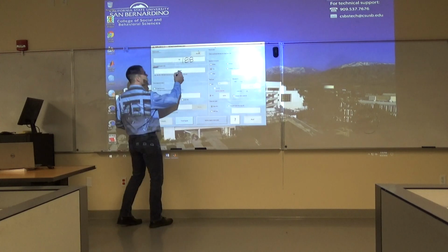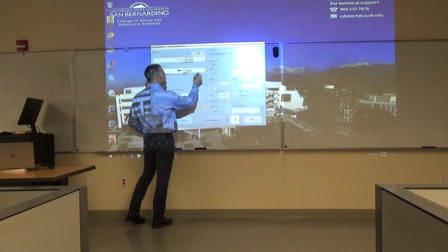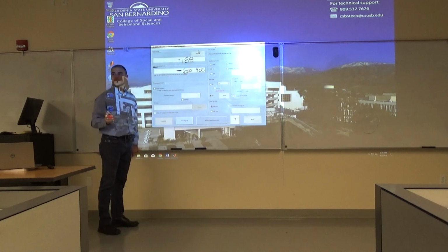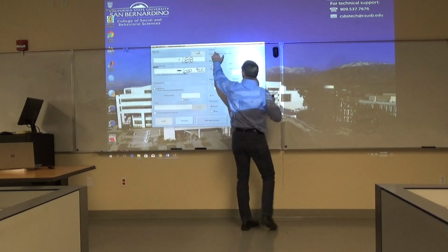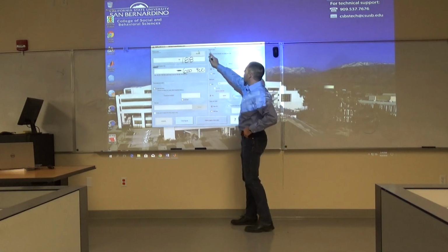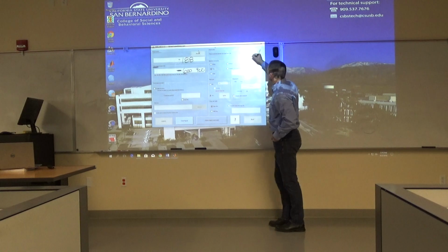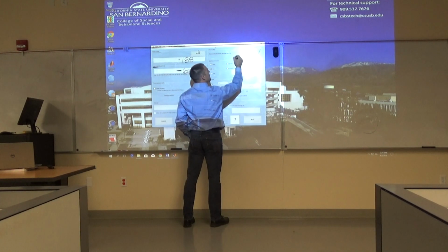So what you should do here is type in, say, for now, 600, and then a space and put 900. A couple other pieces of information. It's going to ask what do you want to measure here, and you can click this down arrow, and you want to select the one that says mean.